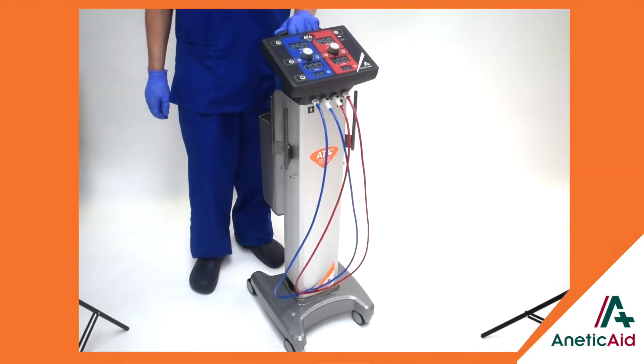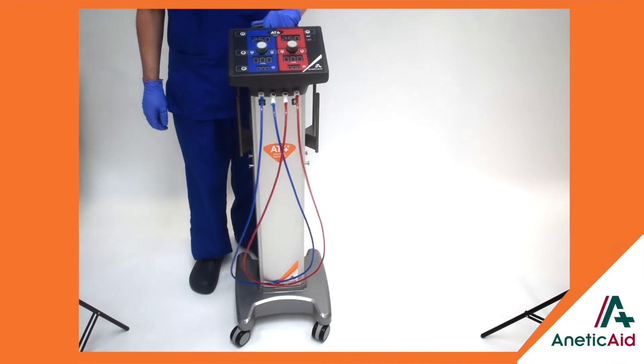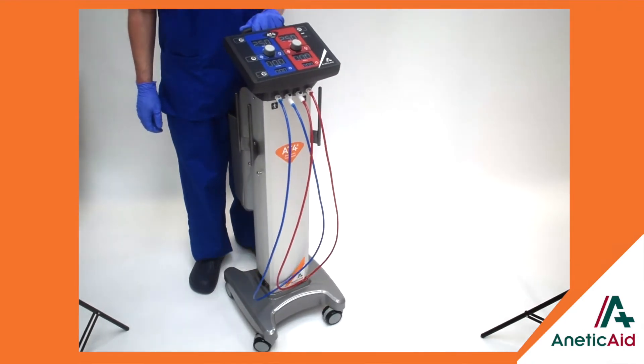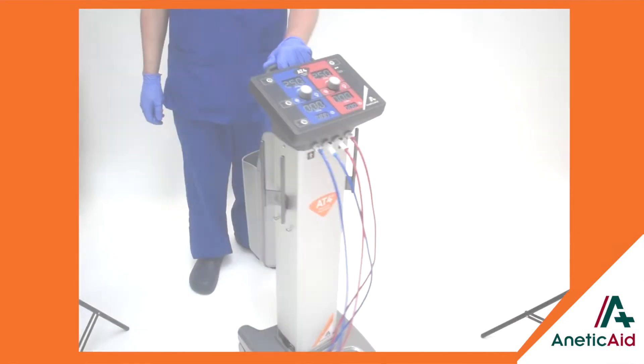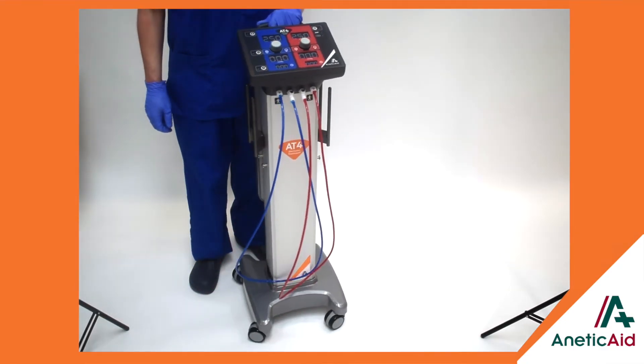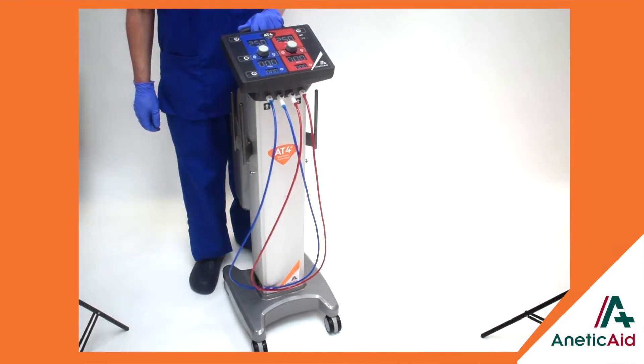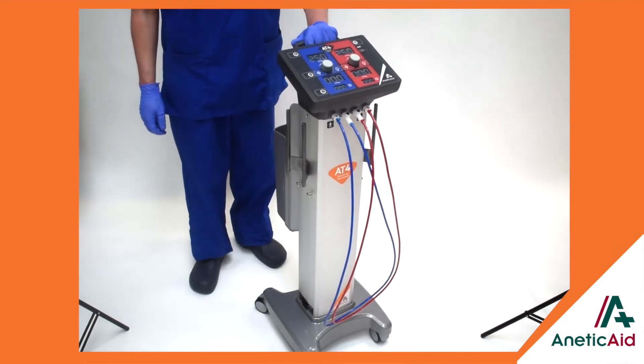At only 17.5 kilos, the AT4 is light and supremely manoeuvrable, and its compact footprint within the clinical environment makes it unobtrusive while its low centre of gravity ensures maximum stability during transfer within and between clinical areas.